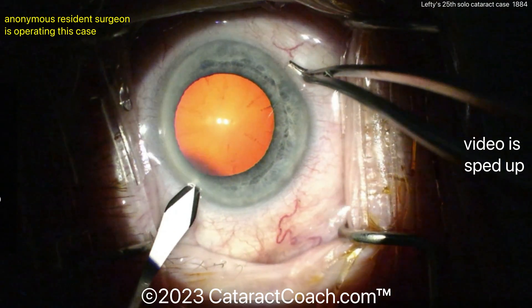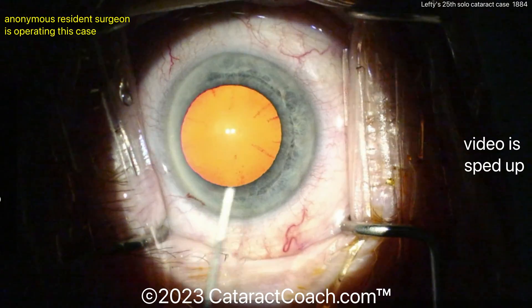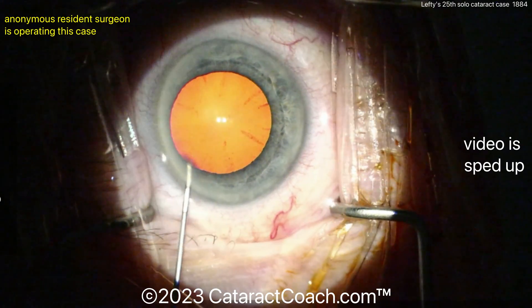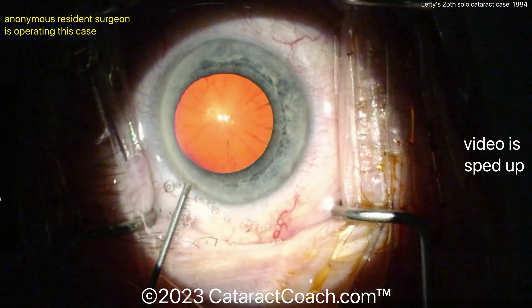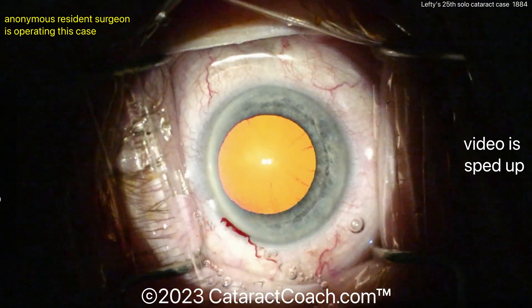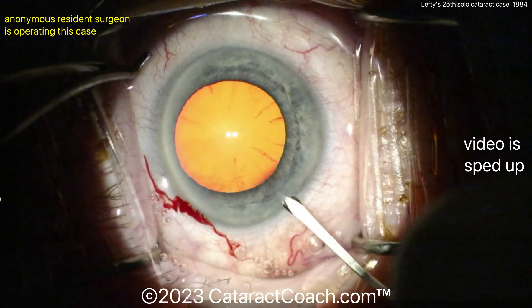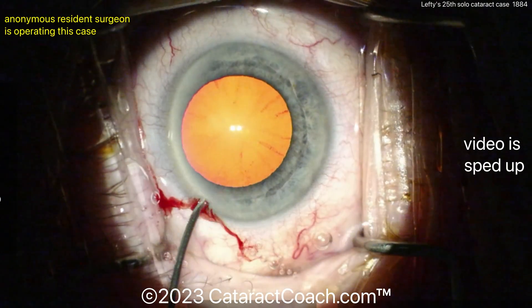The first thing we should notice is the incision for the left hand — I like it, it looks fine. Good draping. I don't like the lighting here. You see the lighting? There are two reflections off the center cornea there — that Purkinje image. Those are the two coaxial lights, one in each ocular, lined up with each ocular, and that gives a great red reflex. But all the rest of the screen is very dark outside that central circular area, because there's no paraxial lighting here.